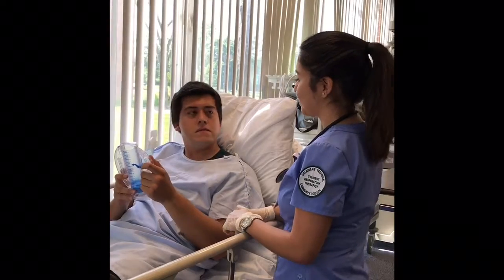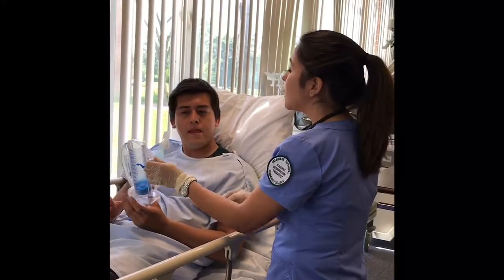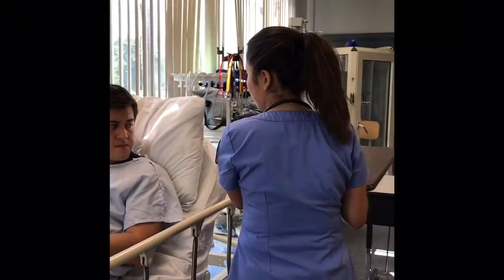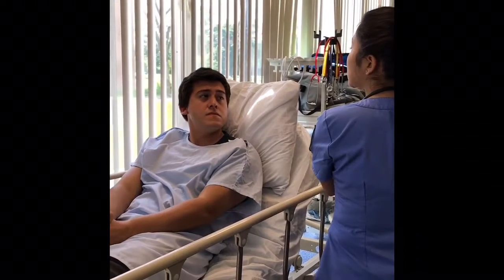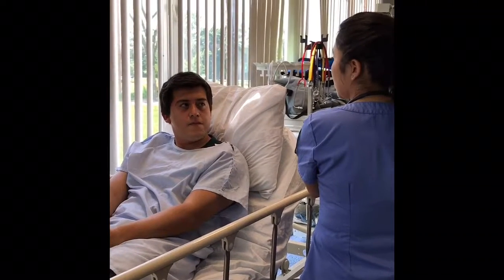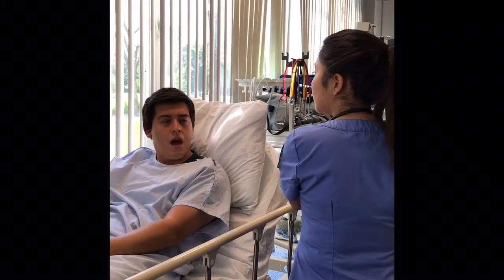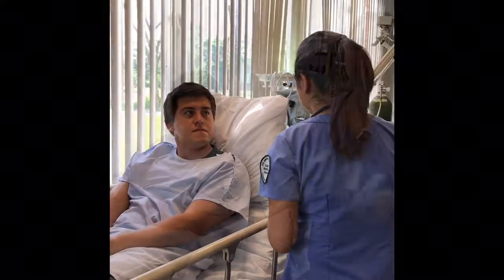After the patient has correctly performed the maneuver, instruct them to perform the therapy 6 to 10 times every hour. Make sure to assess the patient's performance and coach them if needed. Also, remember to encourage the patient to cough. When documenting in the patient's chart, record the predicted goal volume and the actual volume obtained. Don't forget to report any abnormalities with this therapy.